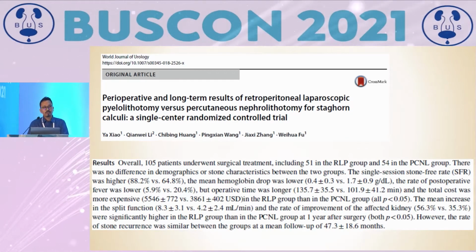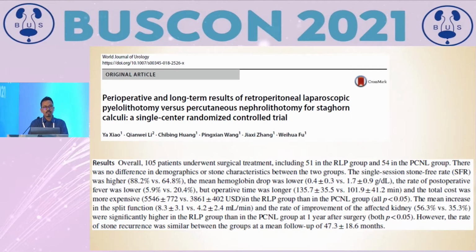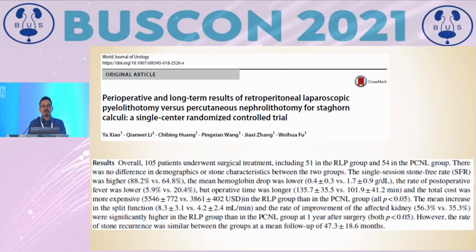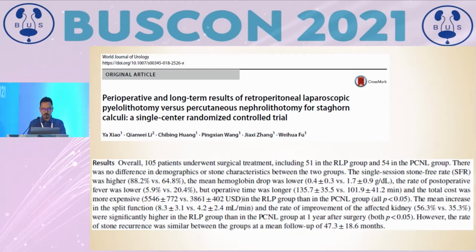Now, coming to the learning curve, it is said that lap pyelolithotomy requires a higher and steeper learning curve. That is because we are usually not easy going for intracorporeal suturing, but with big training institutes and better training, we will be able to do it easily. Even for a PCNL, it is said that unless you have done 50 PCNLs, you are not aware what a real PCNL is. And it goes the same for lap pyelolithotomy as well. If you are selecting more cases, then only will we be able to learn that lap pyelolithotomy is actually something that we should go for.